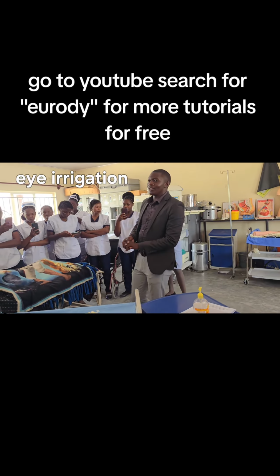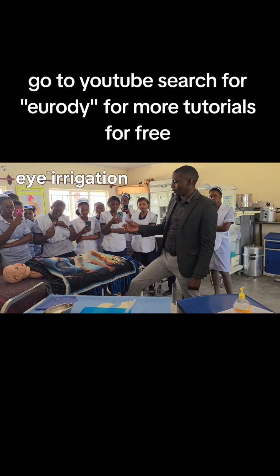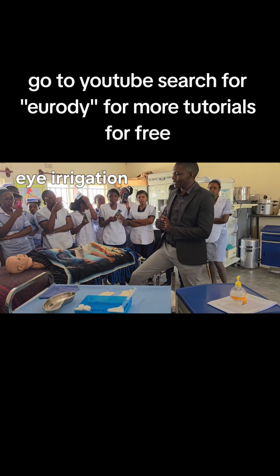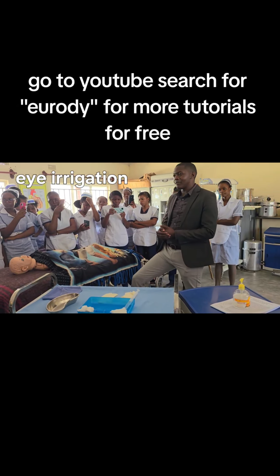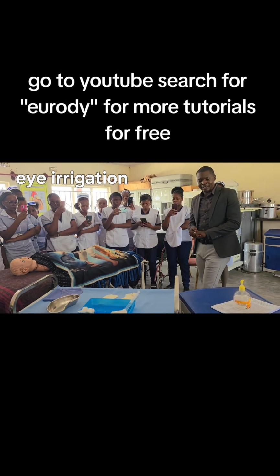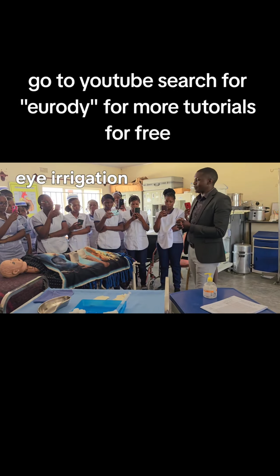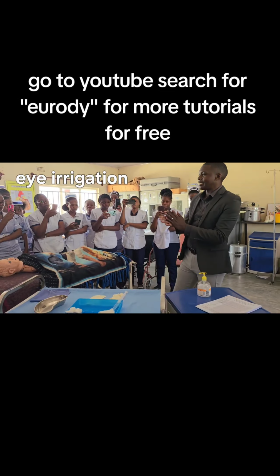So as usual, let's say the scenario reads: Mr. X was brought to your department with eye infection. As the nurse on duty, you have been tasked to perform eye irrigation as for installation of eye drops. As soon as you read the scenario, first things first, you're supposed to wash hands and dry them. In place of washing hands and drying them, we use sanitizer.